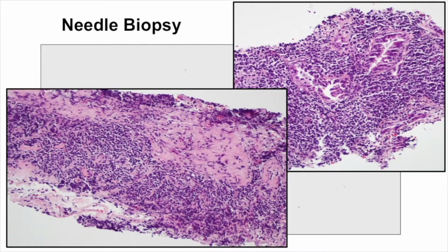And this is how the needle biopsy looks like. This was a very difficult sample for us to diagnose because the patient had a diagnosis of carcinoma. So we were looking for carcinoma, but in addition to the few glands of cancer that this patient had here, there was also a very intense lymphoid infiltrate around the malignancy, and this was the only area where the lymphoid infiltrate was seen. So the question was, is this something that is reacting to the tumor, or is this an actual marginal zone lymphoma in the lung?